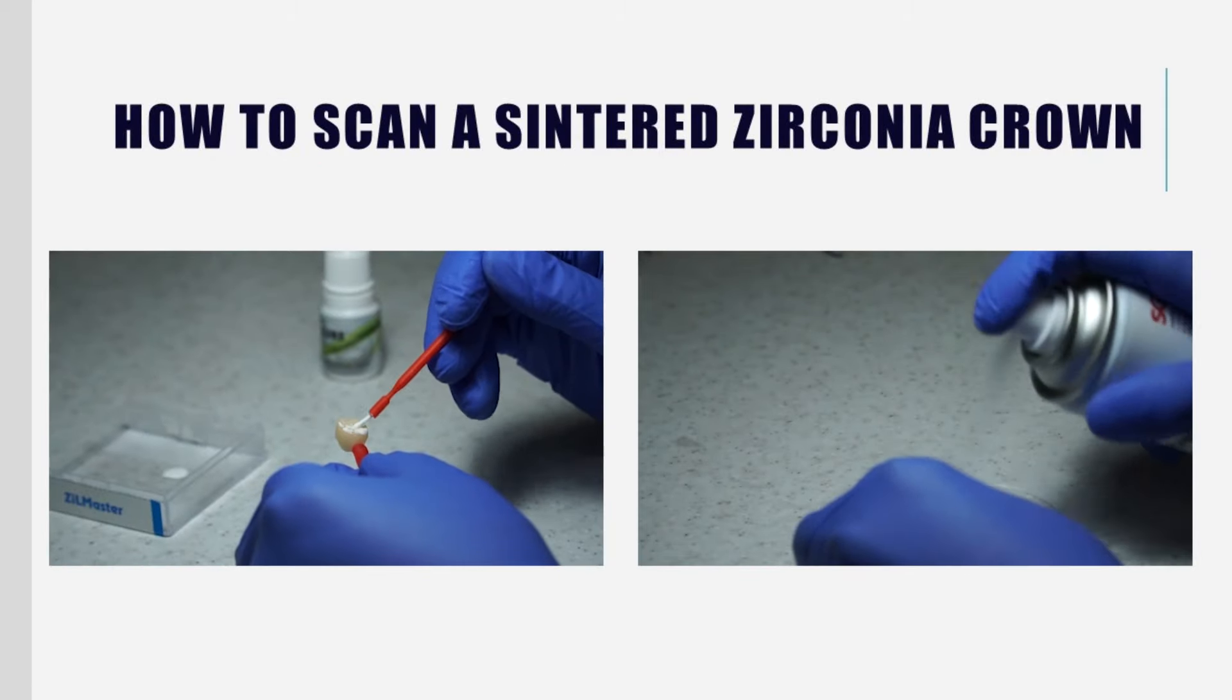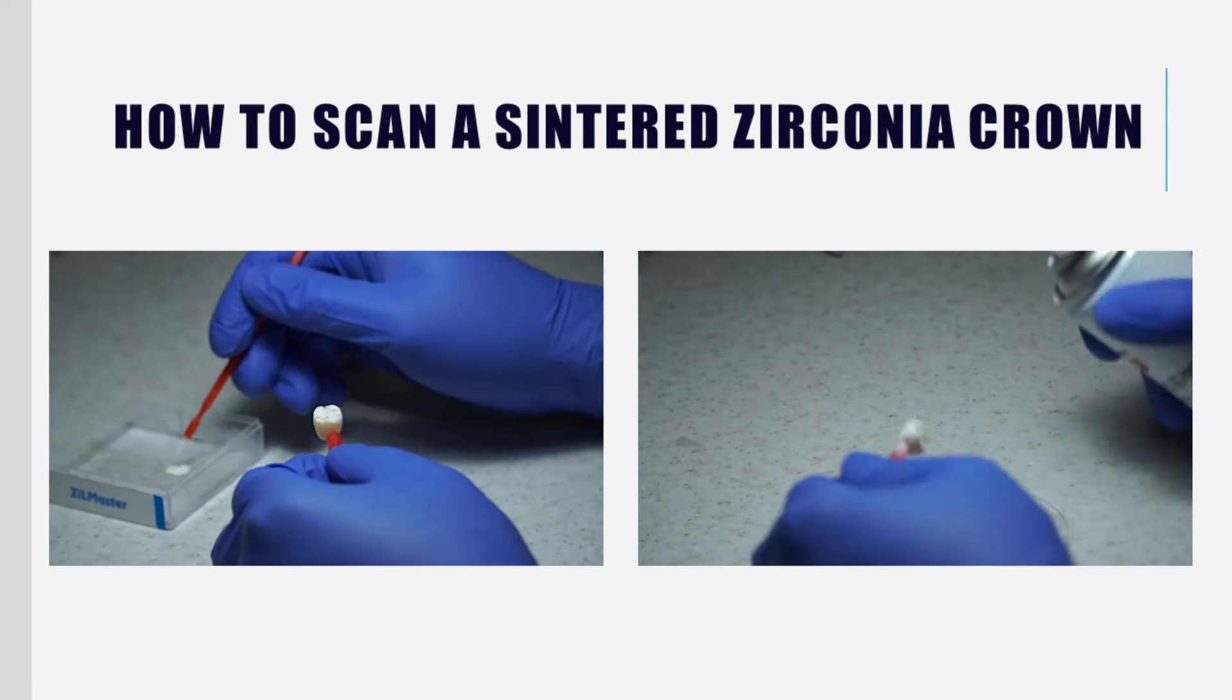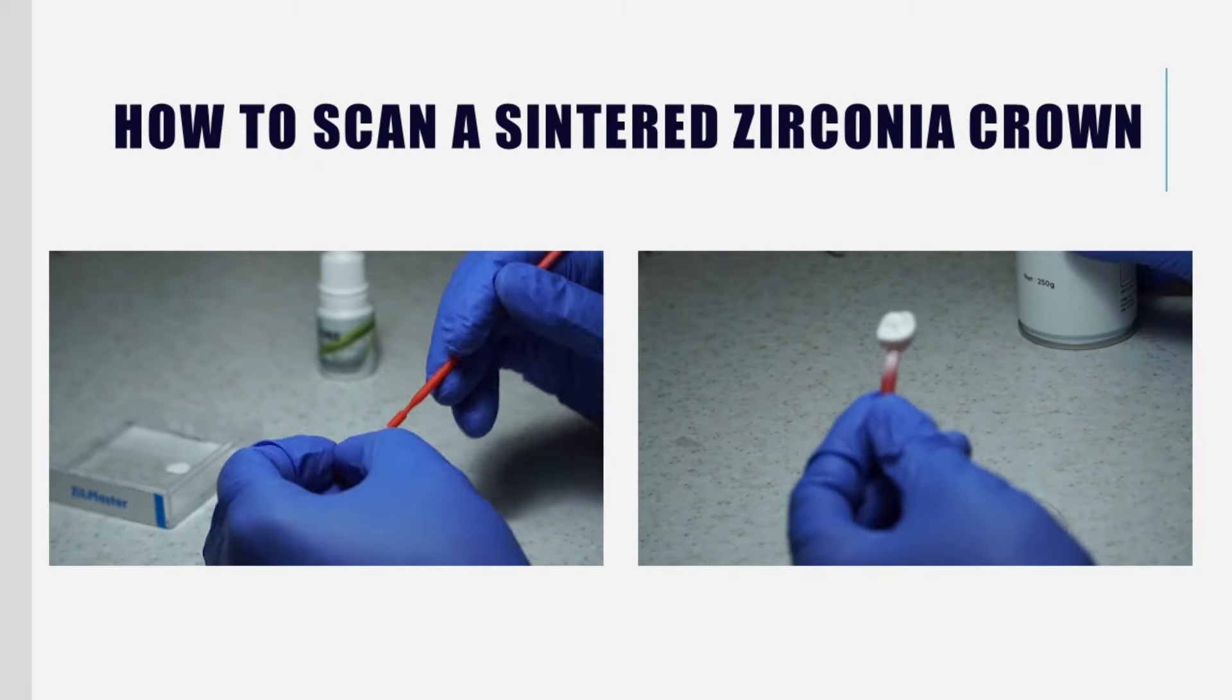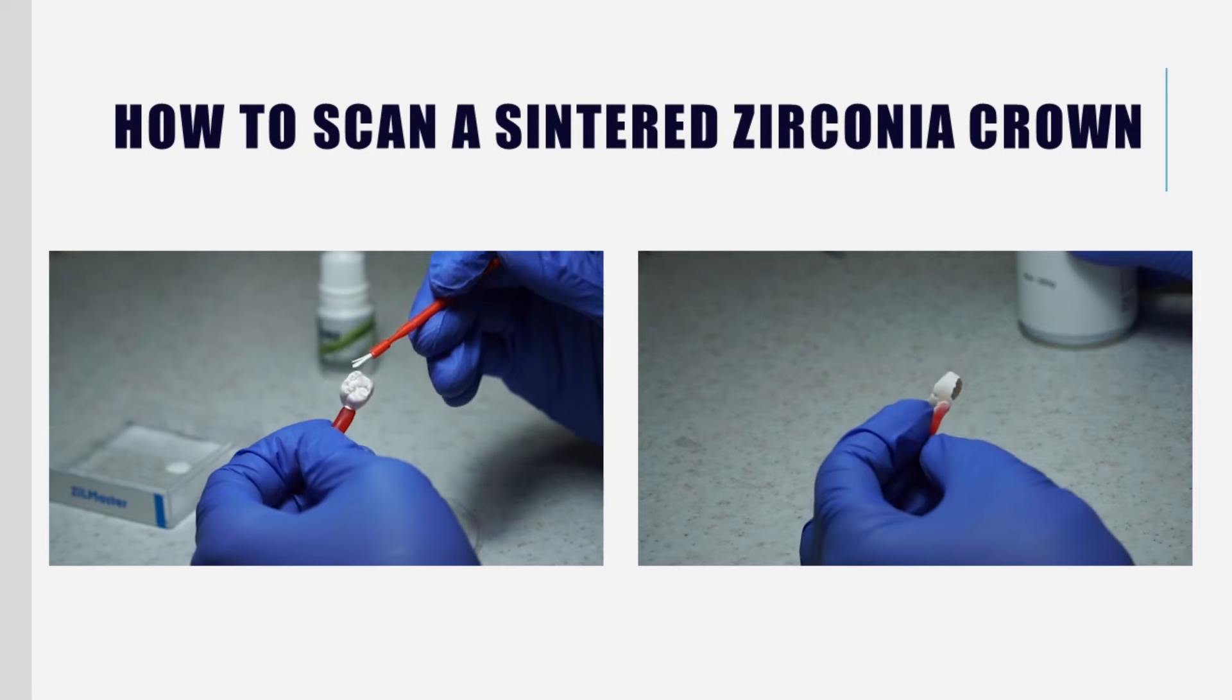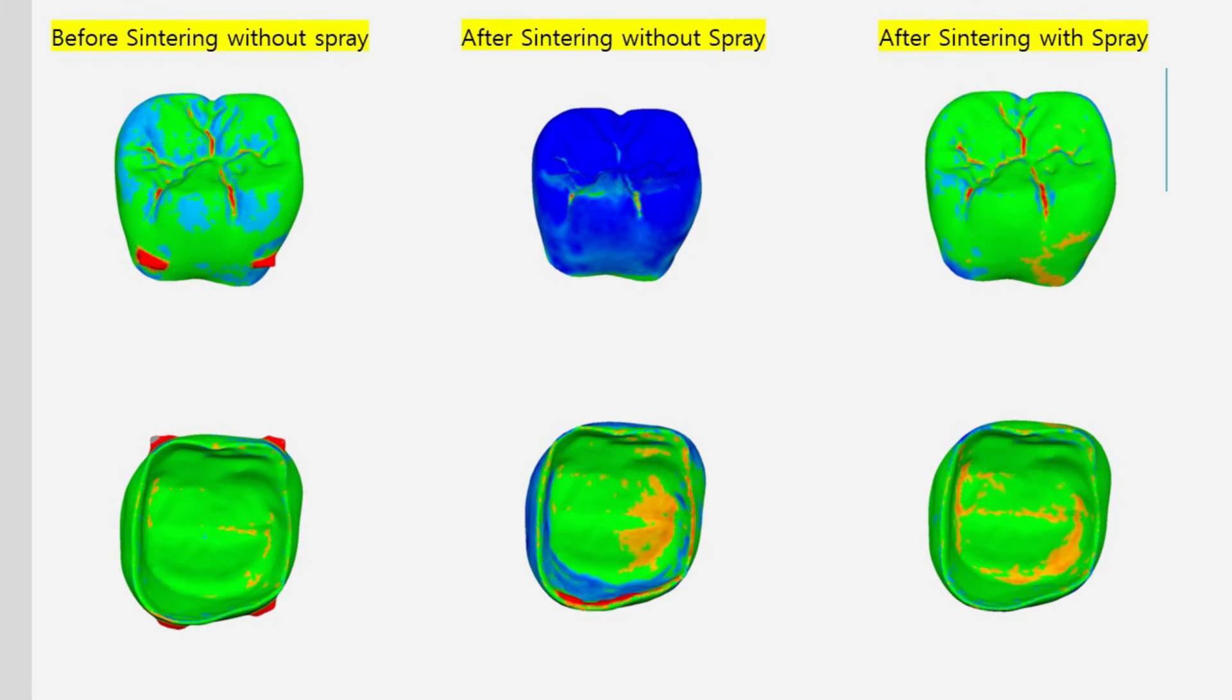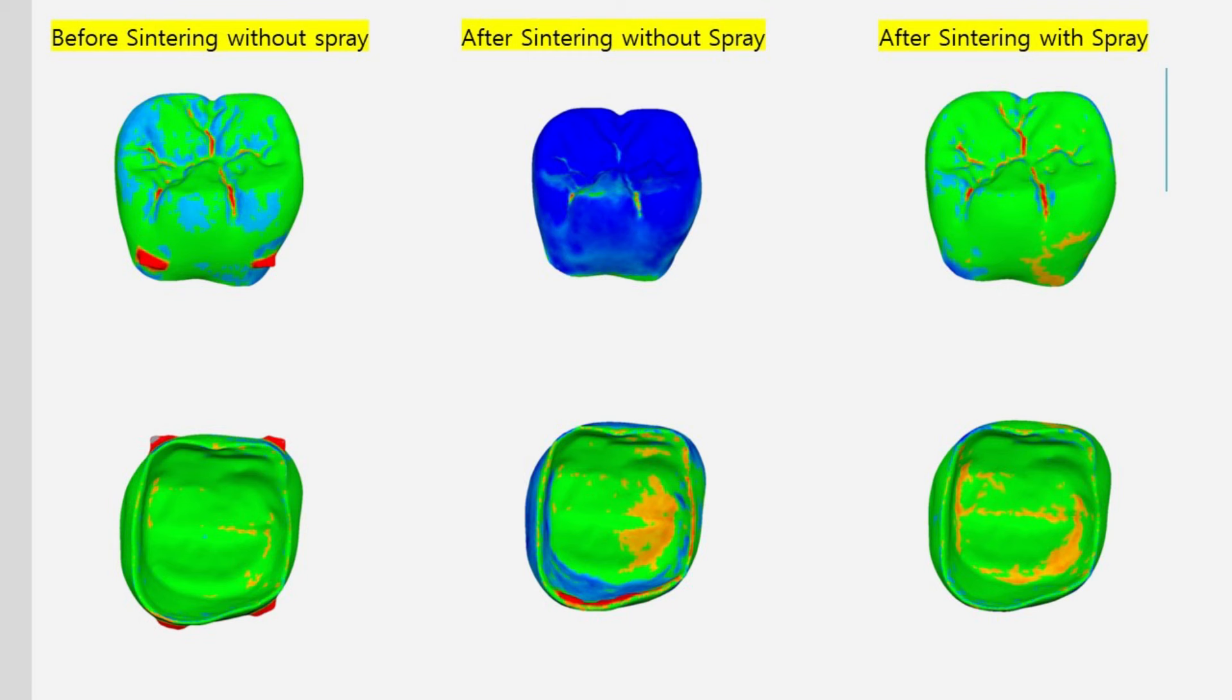Sintered zirconia crowns tend to scan small due to light reflection. They must be sprayed. On the left is a scan before sintering. In the middle is a scan without spray after sintering. On the right is a scan after sintering and spraying. In the middle, we can see that the crown is scanned very small. Therefore, when scanning a sintered crown, it must be sprayed.